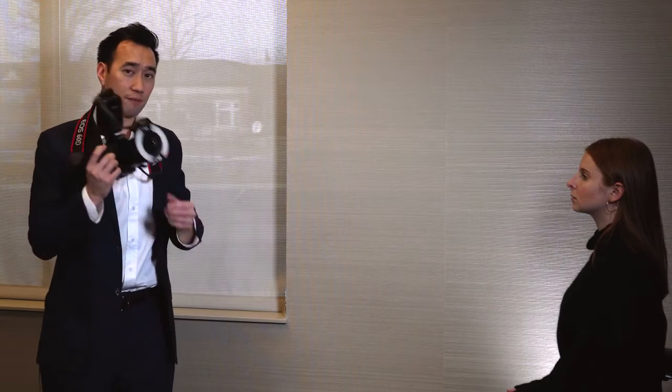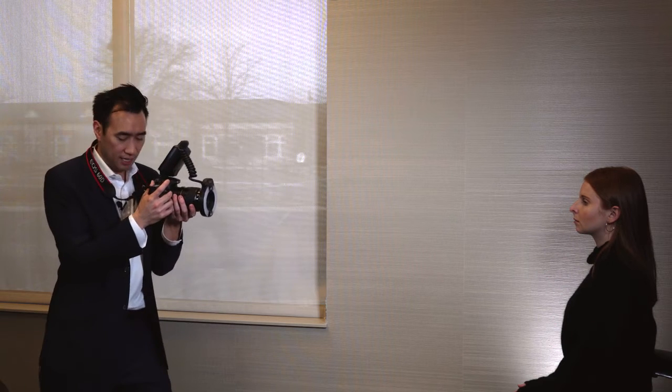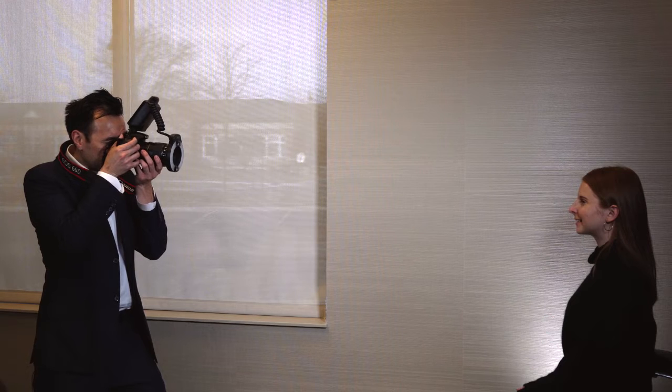When I'm taking the photo I'm going to push the shutter button halfway down. This will allow the camera to autofocus and then I'll press the shutter button the rest of the way to take the photo. I'm going to hold the camera by pressing it in the palm of my hand, having my elbows in supporting it, and then I'm going to have her smile big. I want to make sure I see even amounts of her ears on both sides, that it's framed correctly from top to bottom, and that she's in focus.